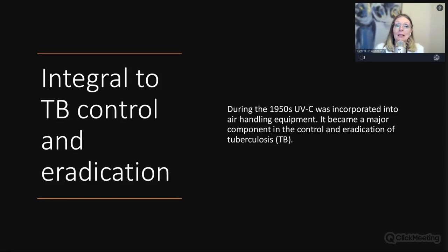So it's important that we understand and recognize why it's so important to really consider UVC light in our practices, because we can't reach all areas, and we have to address the aerosol in some way, not just in mitigation, but what is left with the smaller particles that are still floating around in the operatory that can be sent down the hall or out to the reception area and vice versa.